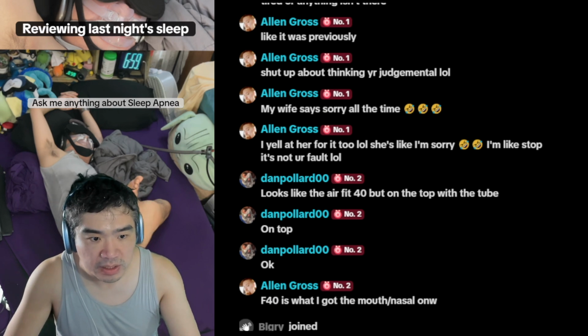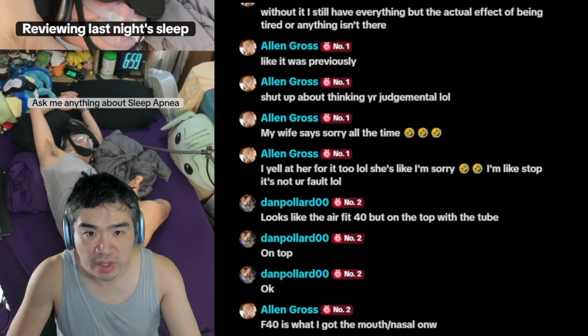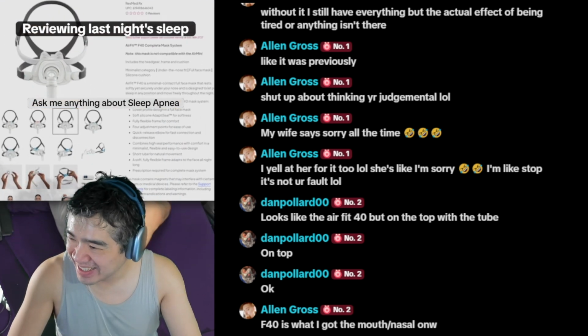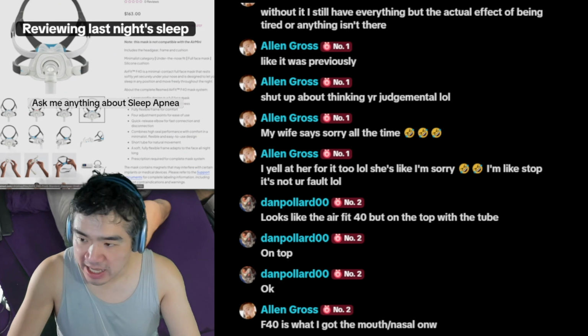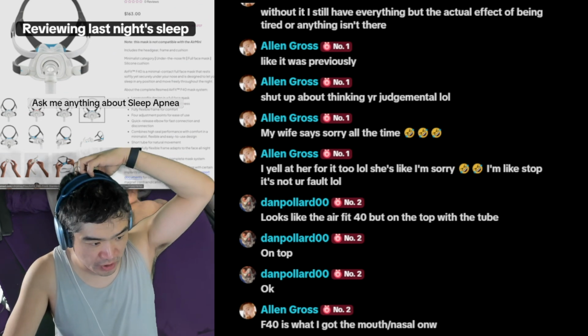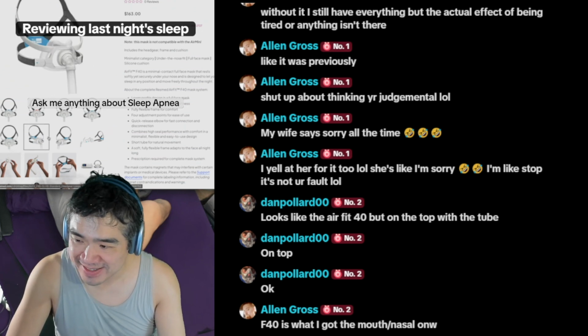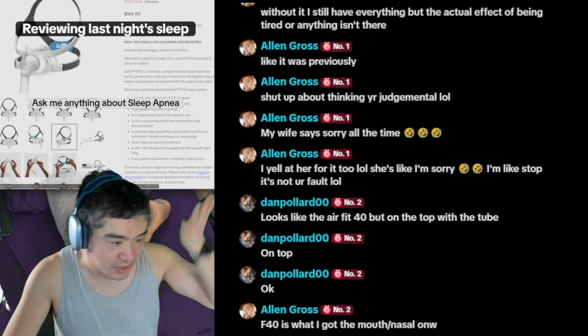Cool. Let me look at this. Complete mask system by ResMed. Accept all cookies. Whoa, this is hardcore. Yeah, I kind of like that the F30 has the hose port on top, because when it's on the front, it's super hard to ignore. And obviously, close your eyes and everything.